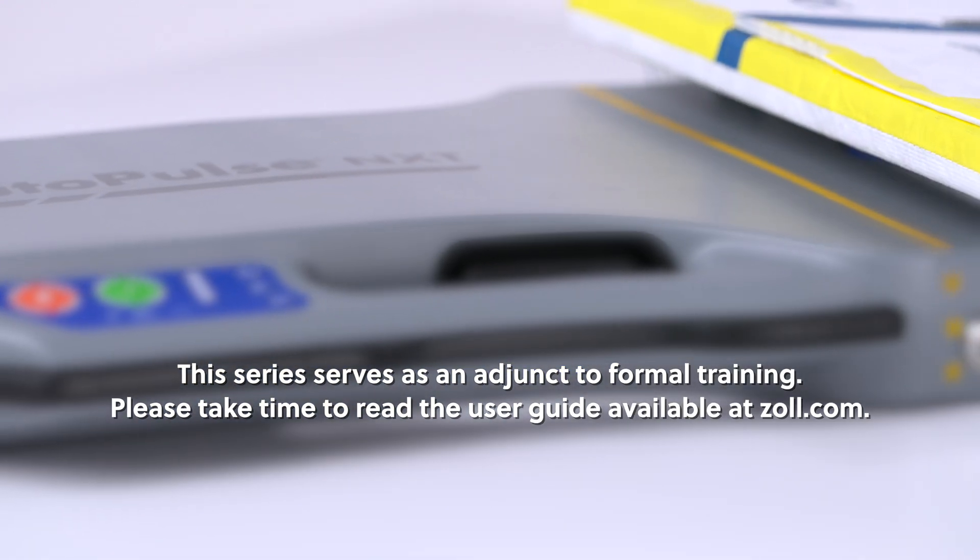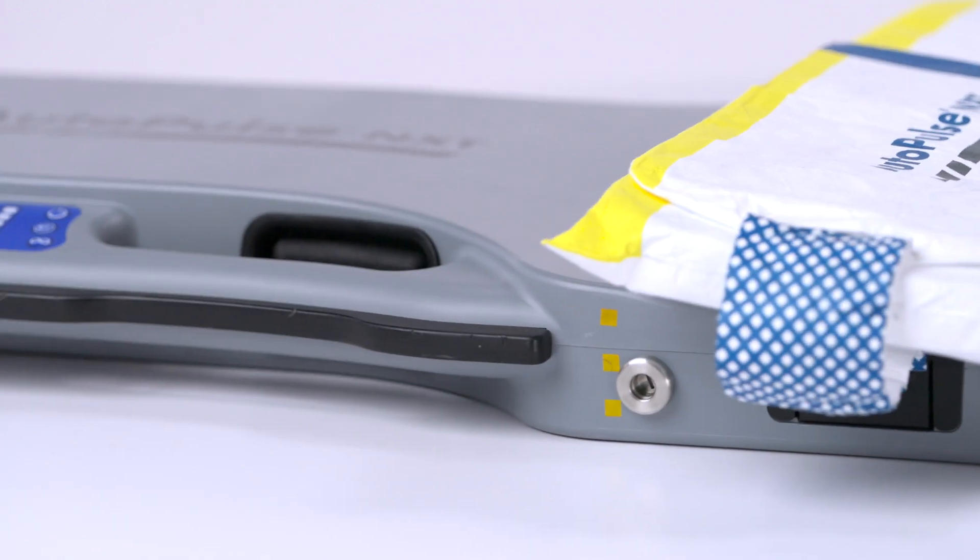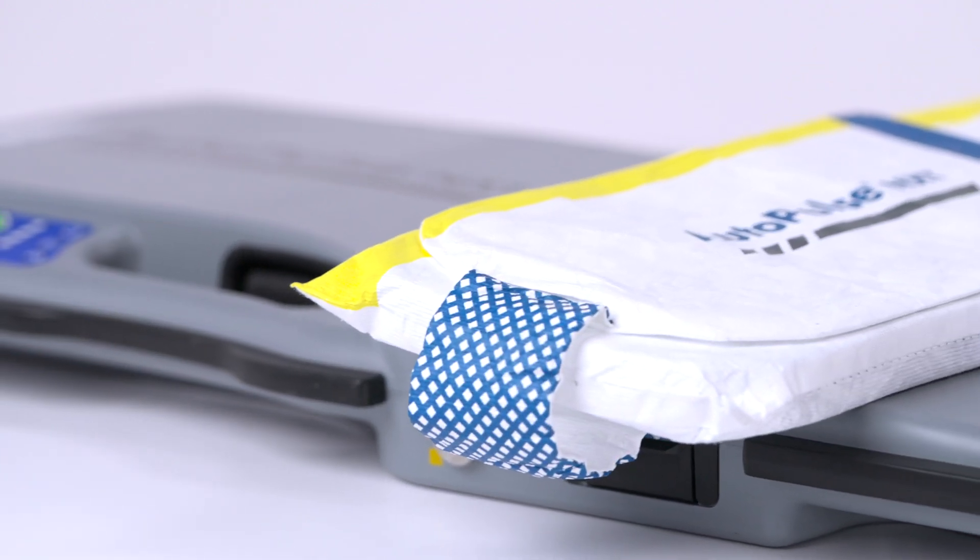Please take time to read the user guide available at zoll.com. Proper use of the system requires a thorough understanding of the product, appropriate training, and practice.